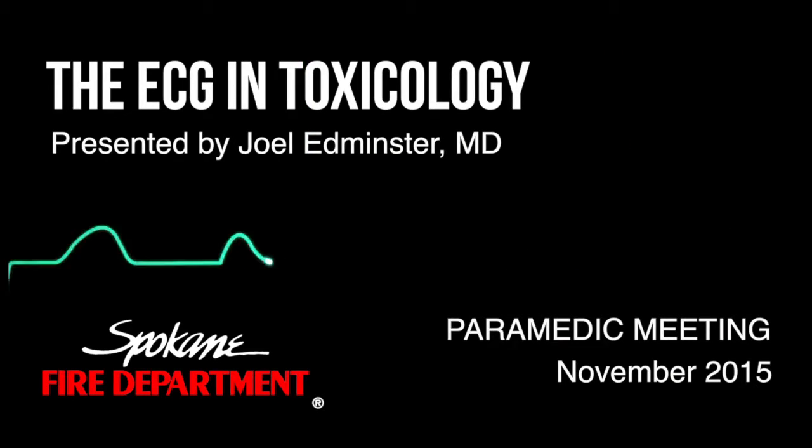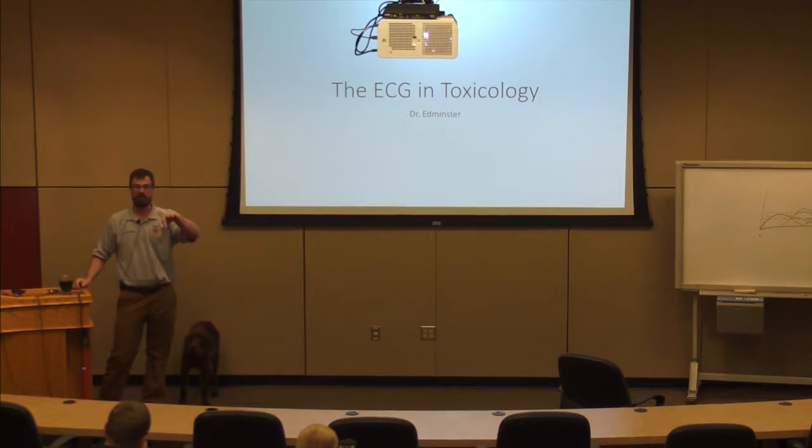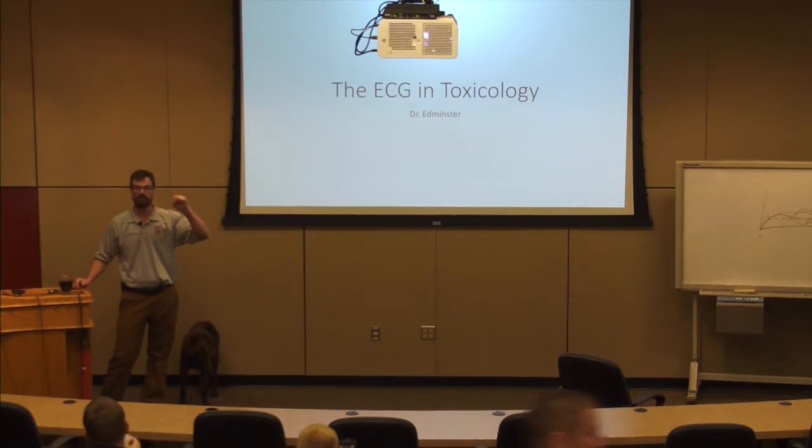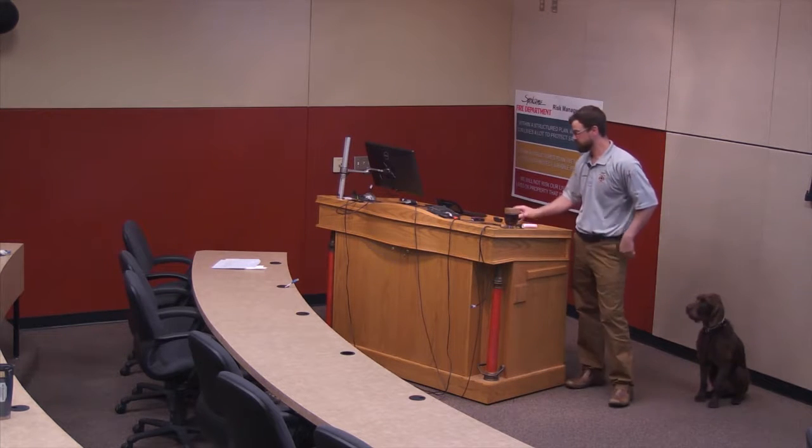ECG tells us a lot more than just ischemia. And if I take it outside of the setting of chest pain, I've got other places in emergency care where it becomes a very valuable tool. And one of those is in the setting of overdose and toxicology, particularly polypharmacy overdose. So I want to take some time to go over some of the manifestations of cardiotoxicity that we can see on an EKG, okay?